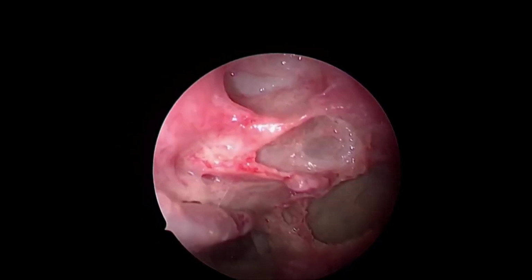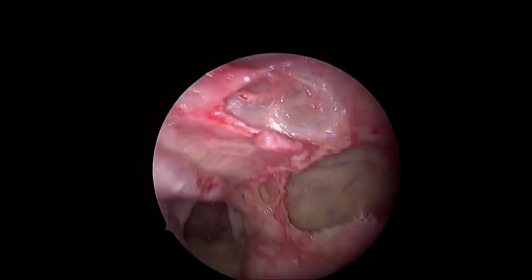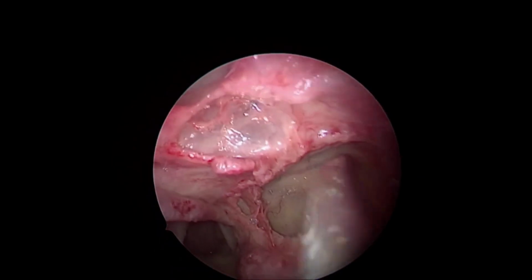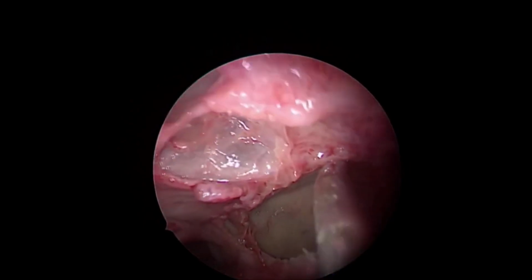So the number one landmark we utilize in our practice, this is purely for the junior colleagues to bring something into practice by default. The first landmark is the maxillary line, the roof of the maxilla or the floor of the orbit.